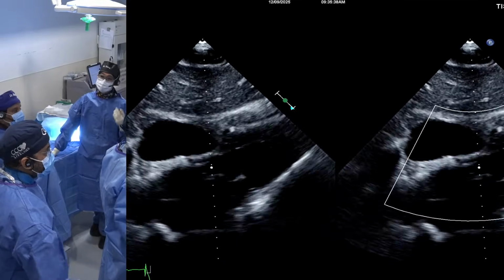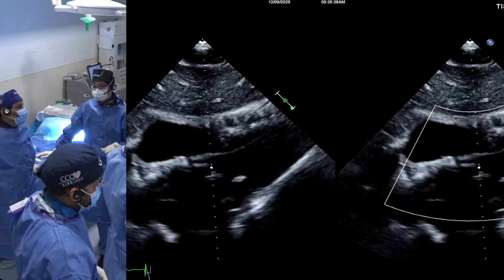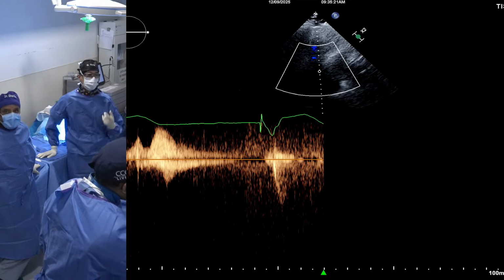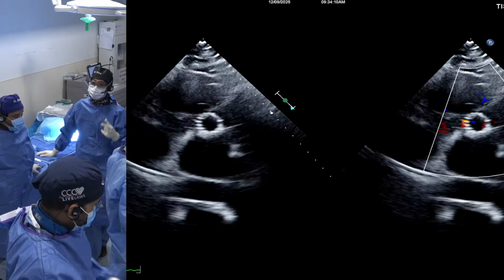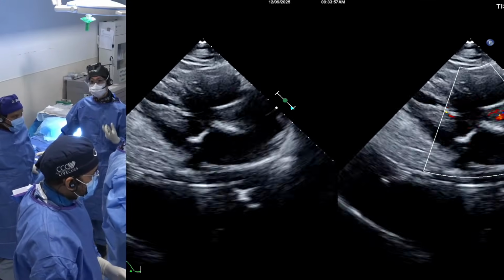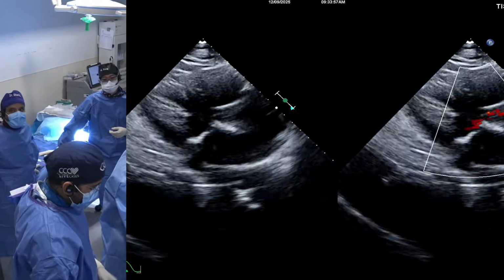Just beware, remember, some of these aortic regurgitation cases are due to prolapse. If the leaflet is prolapsing, you cannot use that leaflet to go through and do the deployment that way. So just beware. We always do these cases under general anesthesia and TEE, because when you pace an AR patient, guess what? The blood pressure actually gets better because you unload the ventricle. So it's more important to do it under a very controlled hemodynamic situation in pure AR patients, because the movement of the device is less predictable.